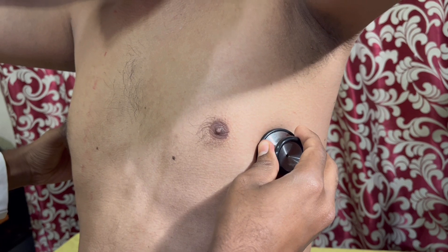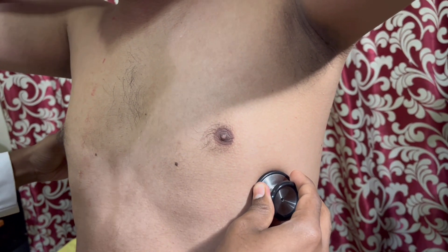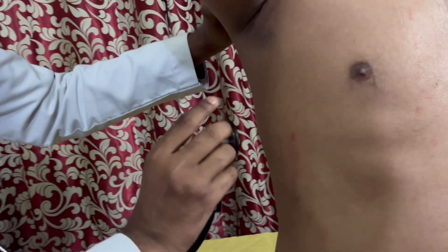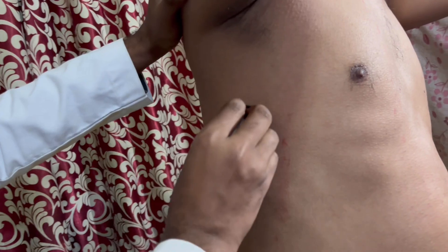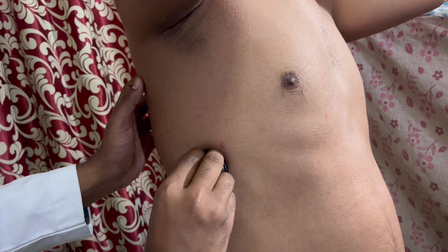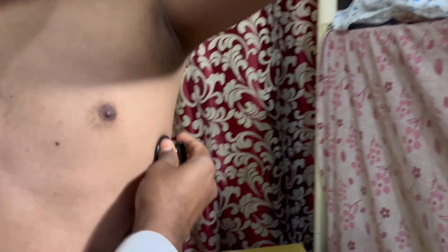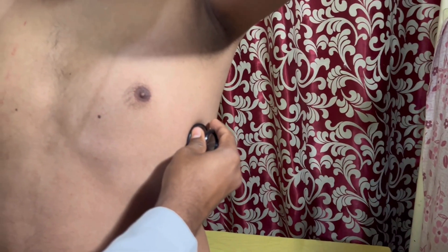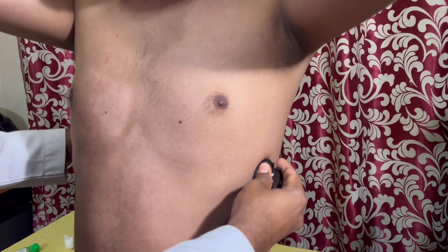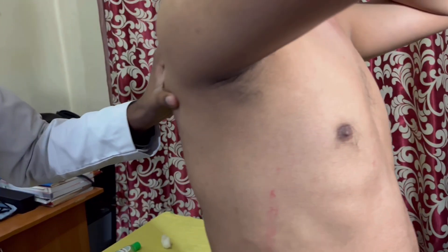Then we auscultate the mid-axillary line at the fourth and fifth intercostal spaces on the right side, then again to the left at the fourth and fifth intercostal spaces along the mid-axillary line. Then for the posterior axillary line, we auscultate along the seventh and eighth intercostal spaces.